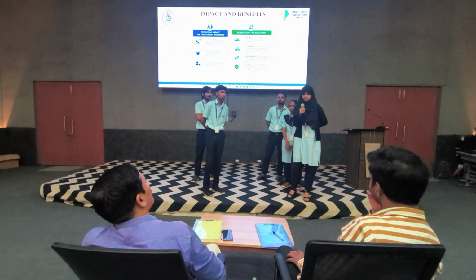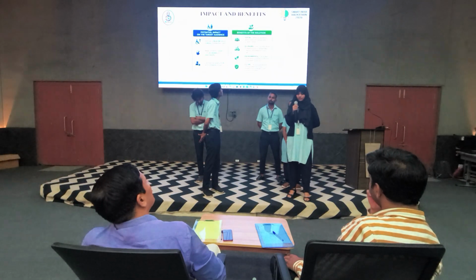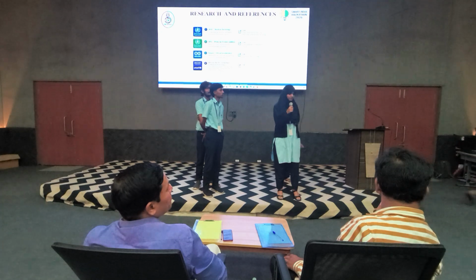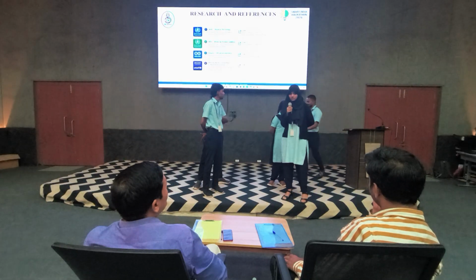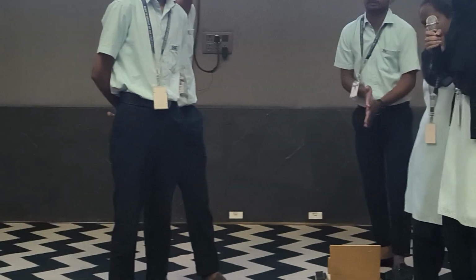Our project has been selected by 9 also. We got 4 lakh funding also, and we are working on it. For the hackathon, we have made a prototype. Our prototype is working with joystick. We are further working on it to make it work on voice control and other systems which we are thinking to add.